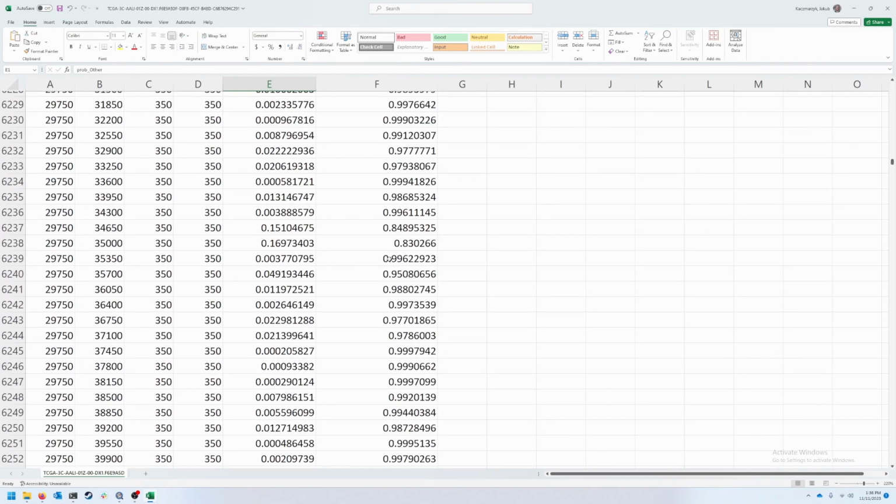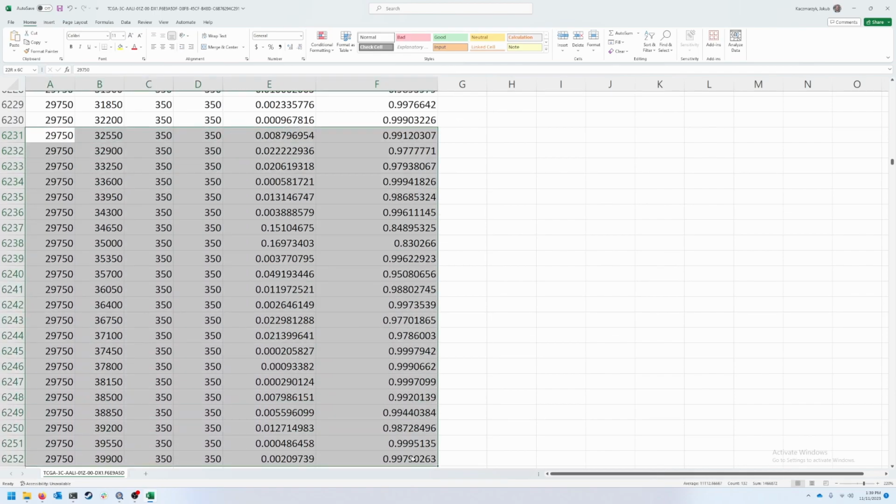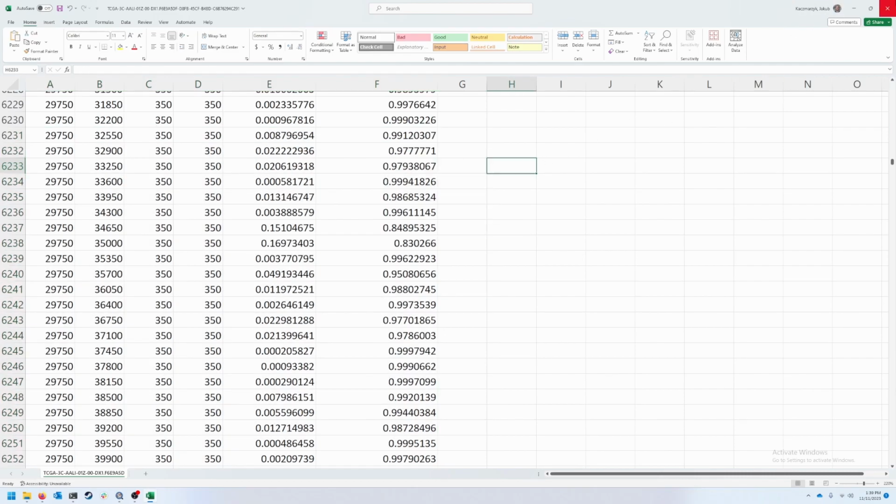So this second column has the tumor values. Here you can see that they're all very close to 1. Here they're all very close to 0. If you sum these, they sum to 1. Great, so that indicates that these patches most likely contain tumor.